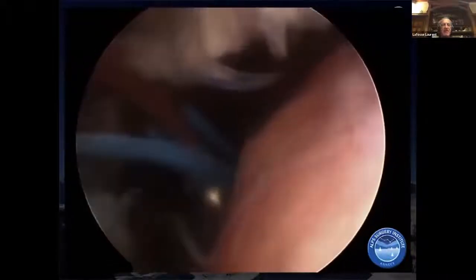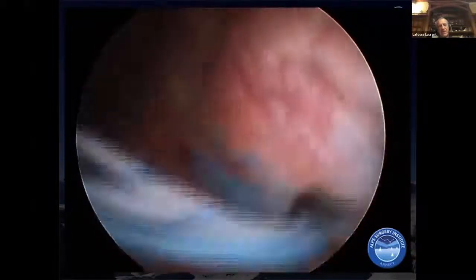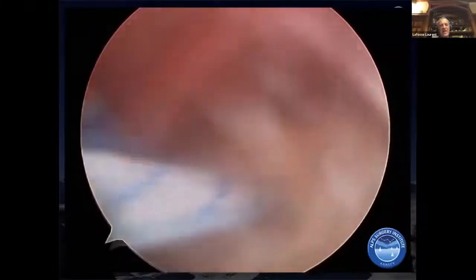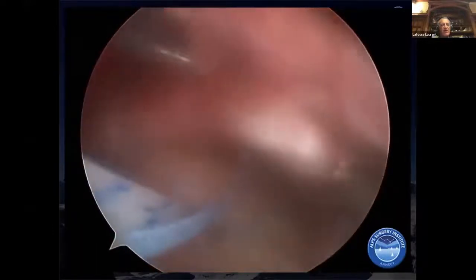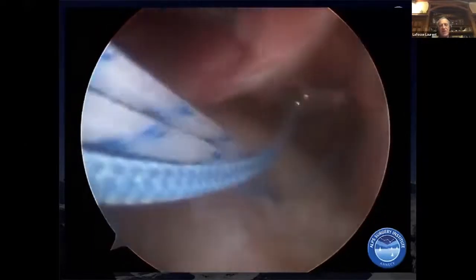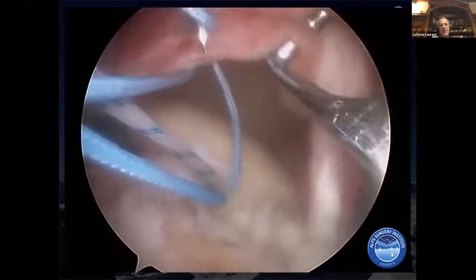So this management of suture is maybe a little complicated to understand at the first shot, but it's not very difficult to understand. And the main advantage is that it will restore the exact anatomy. And then you can use 1, 2, 3 anchors medially to restore the reattachment of the deep layer with the lasso and to go with a mattress through the superficial layer.